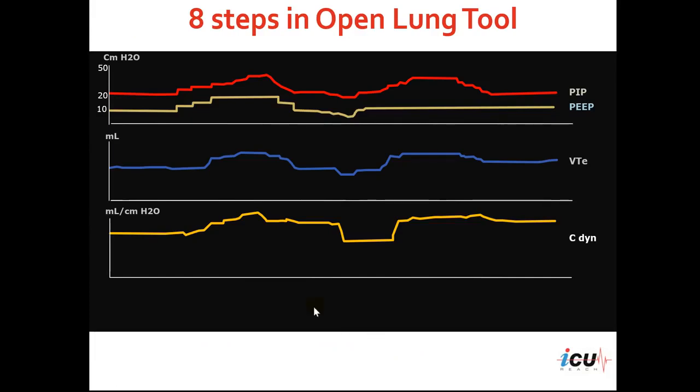We can see here that we are monitoring the peak inspiratory pressure in red, the PEEP in yellow, expiratory tidal volume in blue, and in orange dynamic compliance.